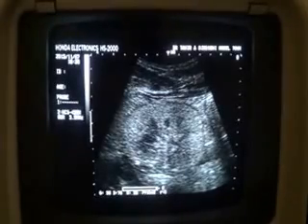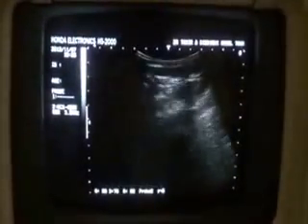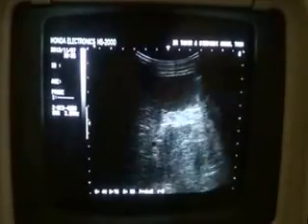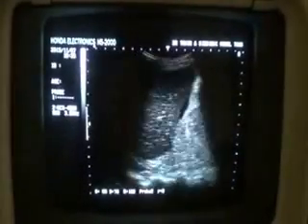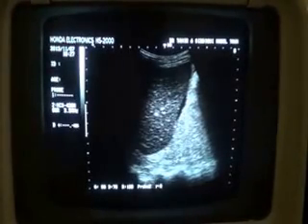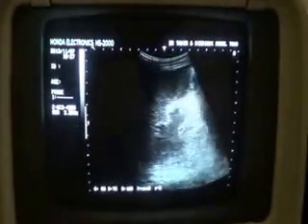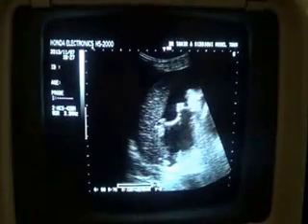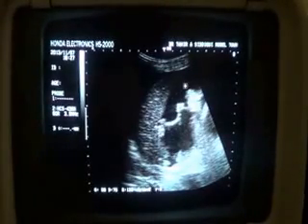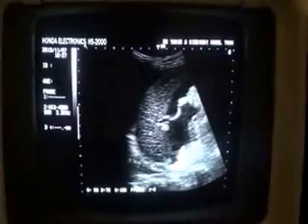But we have some other findings in this case as well. Here you will see that this is the spleen. The spleen shows diffusely decreased parenchymal echogenicity. As you can see, the tiny radicles of the vessels are quite prominent. There is fluid in the abdomen. This is the spleen, and there is fluid in the pleural space. This is the fluid in the pleural space.